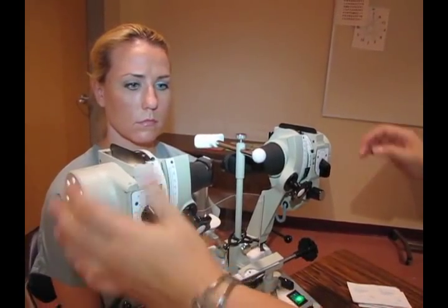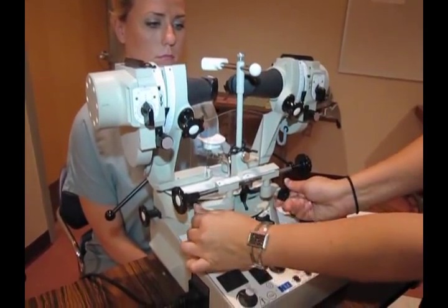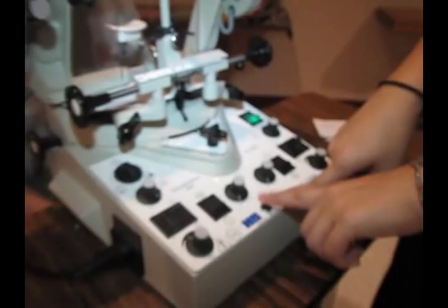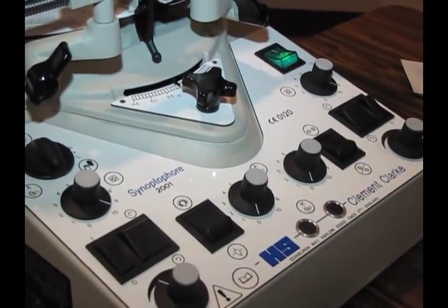And then we make sure everything over here is 0, so I'll do that really quickly. These over here are what lock if you wanted to lock any side. Then the last thing you need to know will be these two buttons, which will be your occluders. Okay, so let's try setting you up.